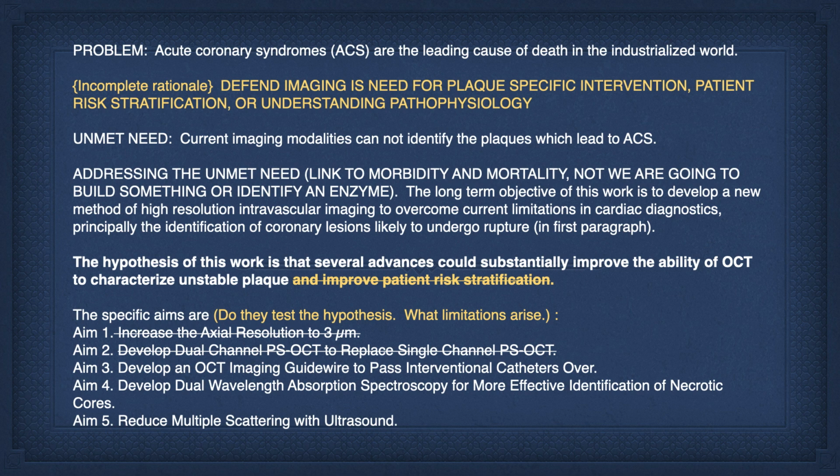Well, I've discussed why I don't think the diffuse border criteria identifies necrotic cores. And whatever a lipid plaque is, lots of different types of plaques are lipid plaques, so I avoid that term. Now, I put down dual wavelength absorption spectroscopy. We actually tested this in the early 2000s, and there are better approaches, but for the sake of here, it illustrates the point. And it was part of this original grant.